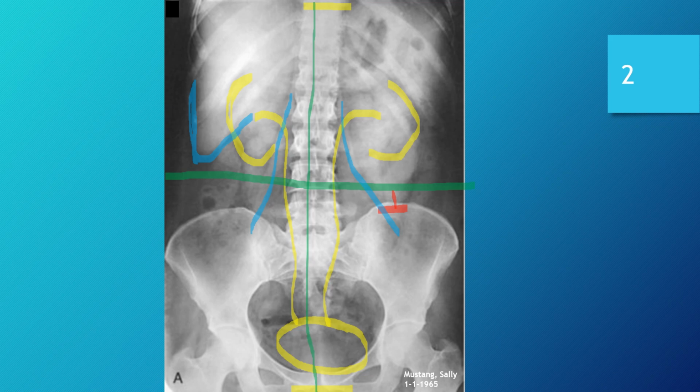We have the ability to determine bowel gas in different regions of the KUB. So we definitely got real good contrast. The brightness looks good. I think the technique that was chosen for this image was very adequate. Absolutely. Okay, moving on to number 4, is the image free from artifacts? Now this one's kind of a trick question, I guess you could say. So what do you think? Is it free from artifacts?